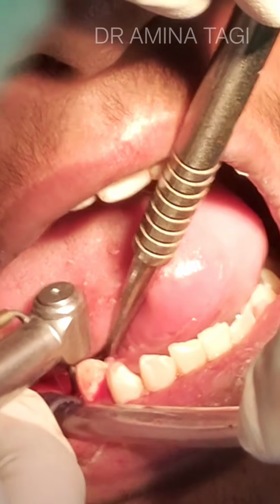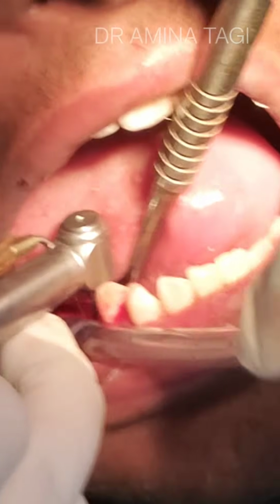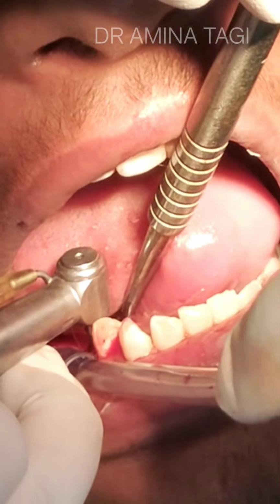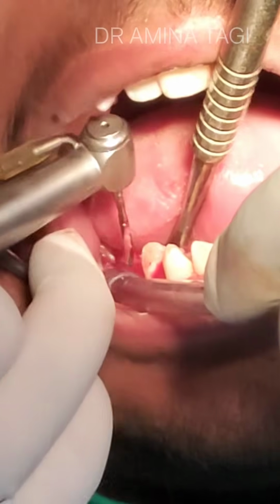80% of the implant placement depends on the pilot drill, as it makes a bed for the implant to be placed, and it also appraises the density of the bone for the entire length of the implant to be placed.